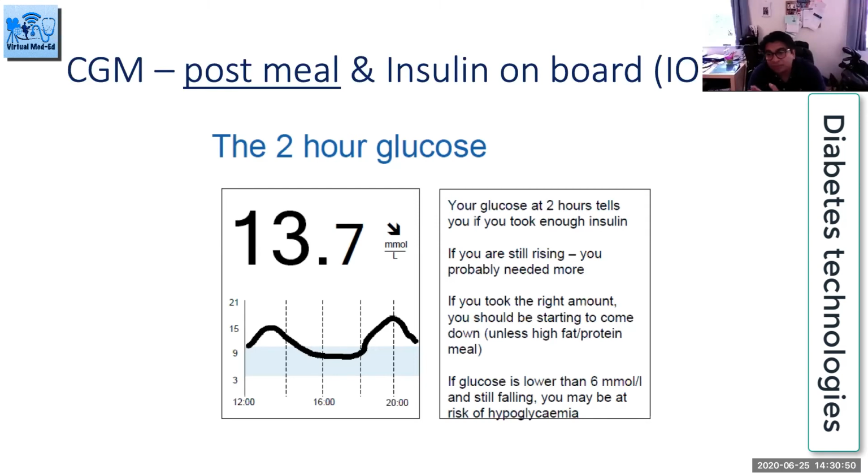And this may be a reflection of the glycemic index of the food, because you've got quite a significant low glycemic index component in your food, and that's probably the reason why it's taking a while to come down. So those are the factors that you need to bear in mind. But I wouldn't do anything because it is very likely it's going to come down at 3-4 hours. I would not do a correction at this point because I know the arrow is pointing downwards.